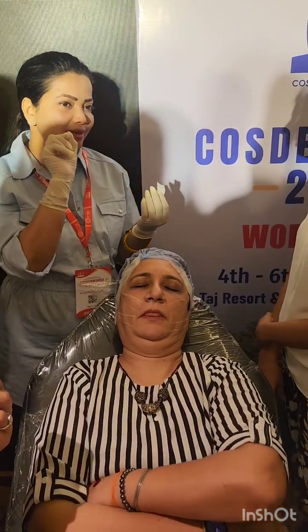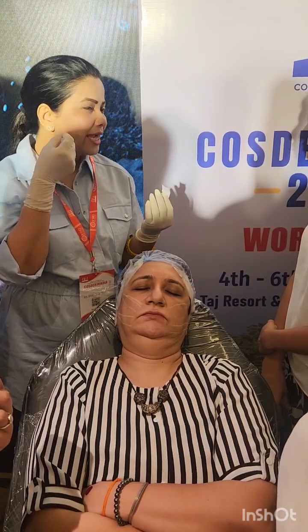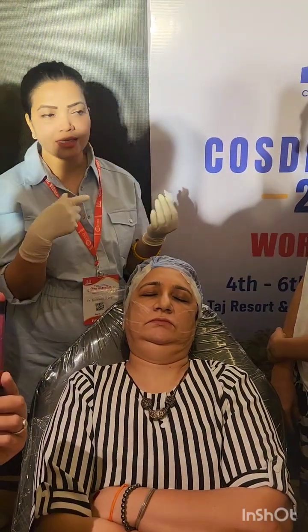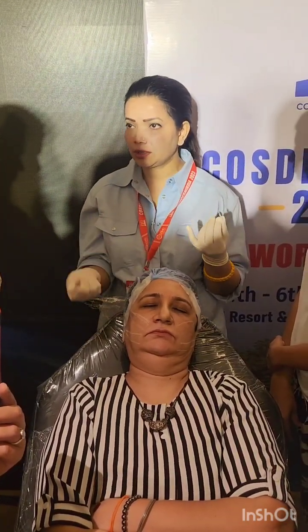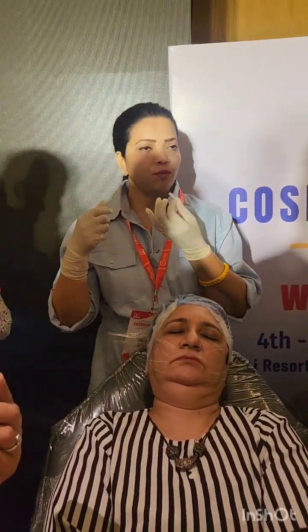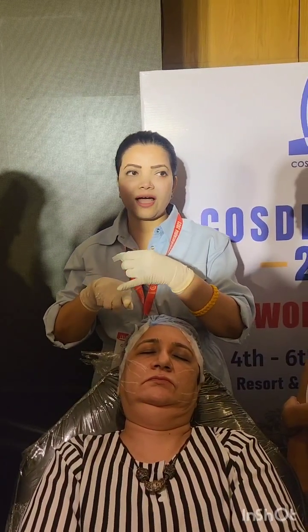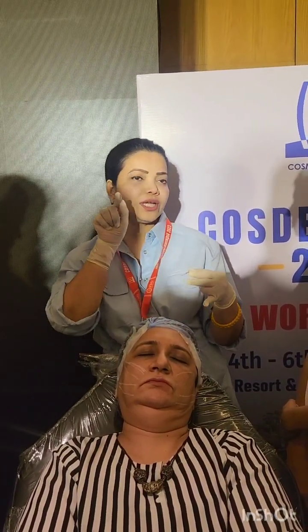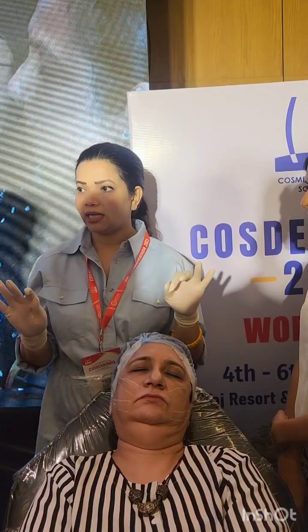It gives a little acne kind of appearance to the skin. So try to reduce it a little, but it doesn't get reduced, because the symptoms actually appear after 1 month. It's not that common immediately, because if it shows immediately, obviously you're going to reduce it. It happens because when you're exiting the skin, you have left the thread a little superficial, so it keeps impinging over the skin. Okay, but that's also not a problem. That also subsides in a month.